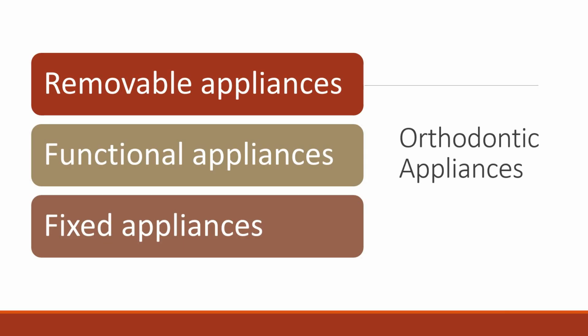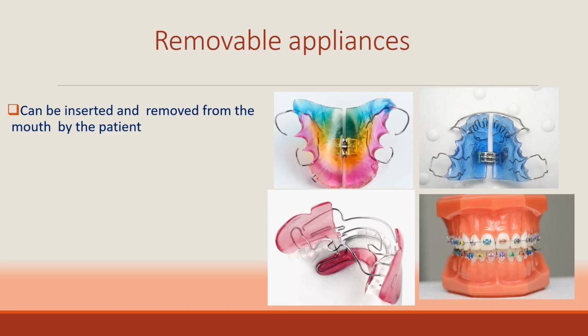Generally, removable appliances are used for simple tooth movement, such as individual tipping or limited expansion. They can also be used as an adjunct to fixed appliances, particularly during bite opening and molar distalization, or prior to functional appliance therapy to facilitate mandibular postural advancement.